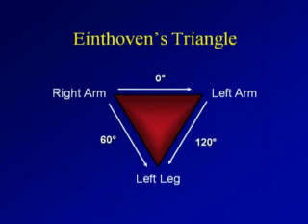The major assumption of EKG is that the body is a uniform conductor. Now, it's not a valid assumption, but it will influence how we're going to discuss some of the morphologies in P waves and in QRSs. To start with, the original lead sets that were used for EKG were called bipolar leads. Bipolar because you had one plugged into negative, one plugged into positive. Now, when they're bipolar, that means they can only see what happens electrically in the direction they're looking.